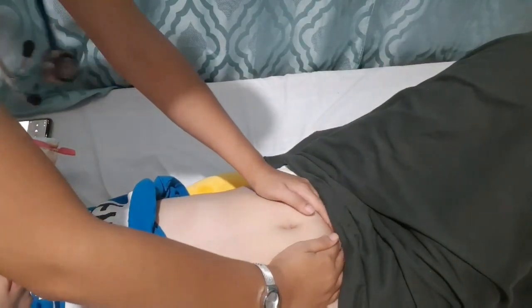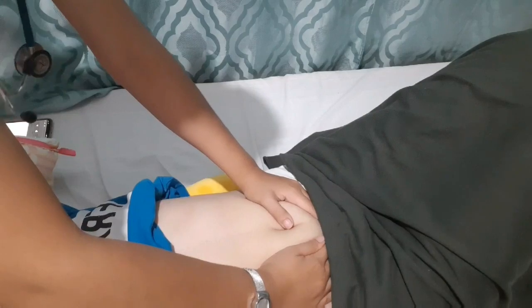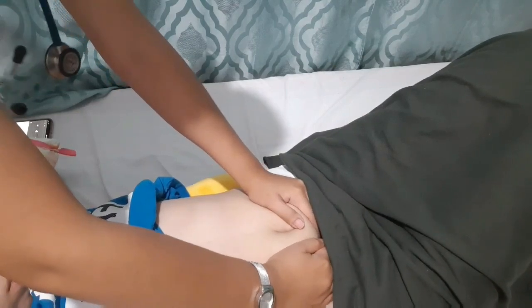Third maneuver. Continue facing the woman. Grasp the portion of the lower abdomen immediately above the symphysis pubis, between the thumb and middle finger of one of your hands. Fourth maneuver. Face the woman's feet and place the palmar surface of your hands on each side of the woman's abdomen. Use both hands to palpate the fetal head, pressing downward gently with your fingertips about 2 inches above the inguinal ligament.